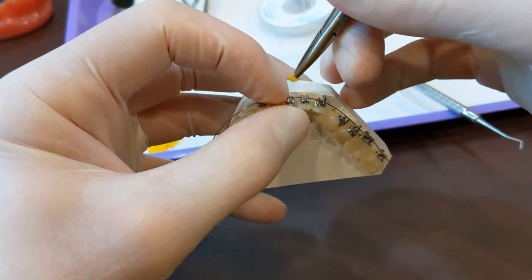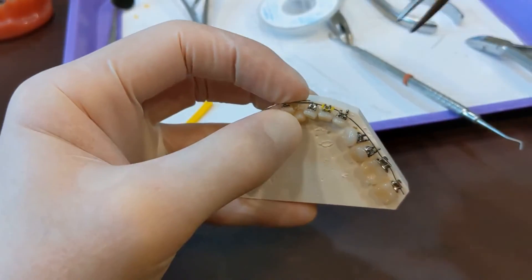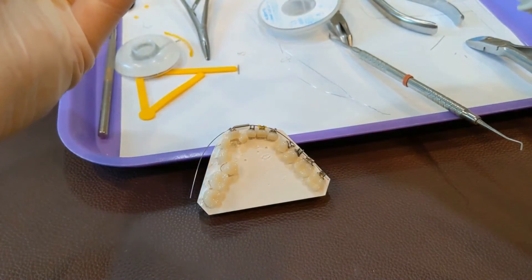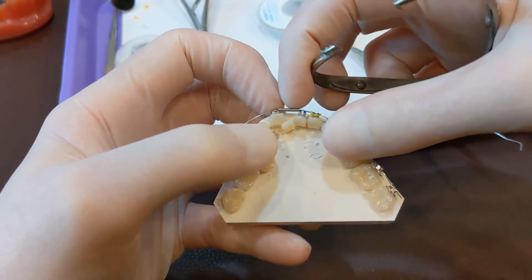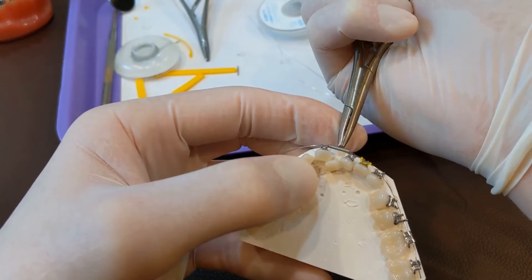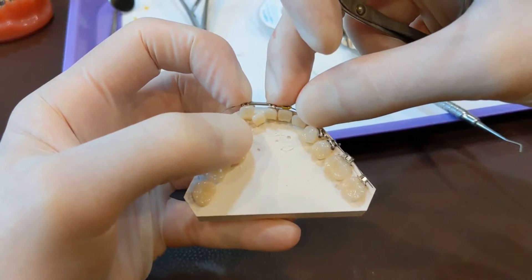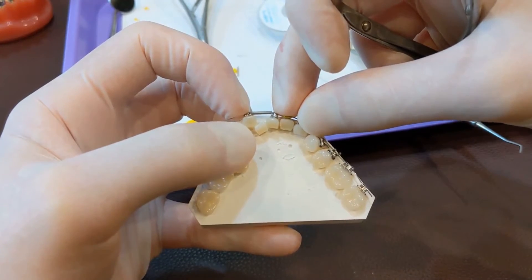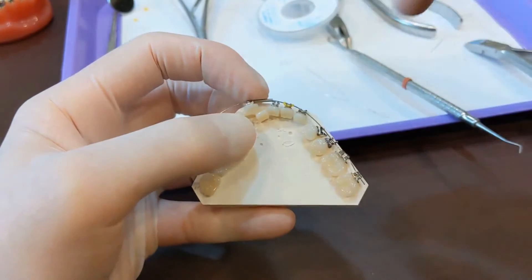Make sure that it fits in between those two brackets and touching both sides. If we called for a flush closed coil, that means touching both sides so no space can close. Make sure your midline of your arch wire is lined up, then put one O-tie to hold things in place. Since we're not actively closing, usually you'll have this on when you have a chain — put the chain on all the way around, skip a link right here, so you have one link on this bracket, one link over the closed coil spring, one link on the other. You can also steel tie each side to make sure it's not going anywhere, then chain right over the top and skip a link where the closed coil spring is. That's how you do a closed coil spring.